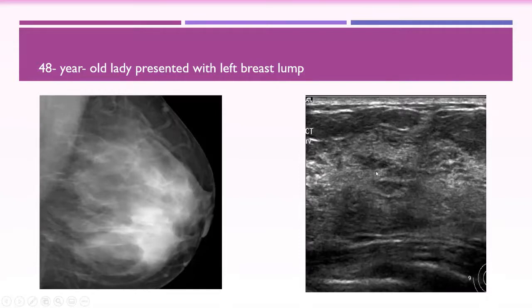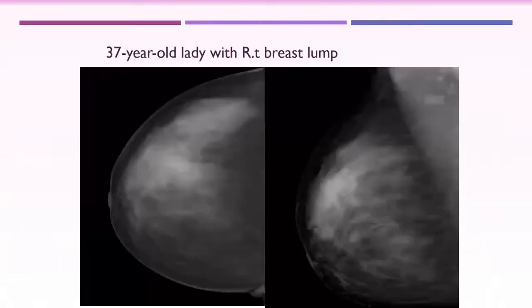And with the size of this fibrous ridge, you can judge the size of the palpable abnormality. If the ridge is small, you will find the palpable abnormality small, like a peanut. If it is large and smooth, you will just feel it the same. It will correspond to the clinical abnormality.